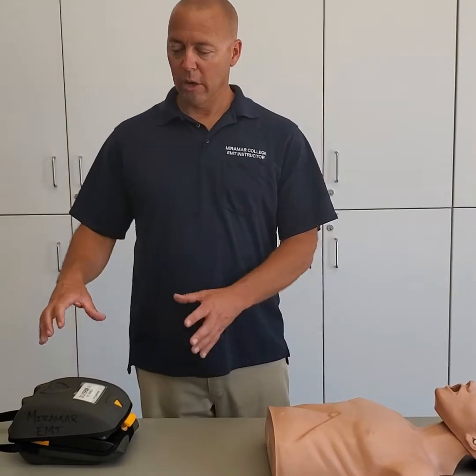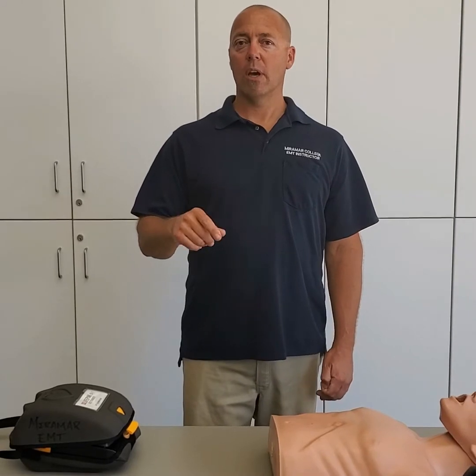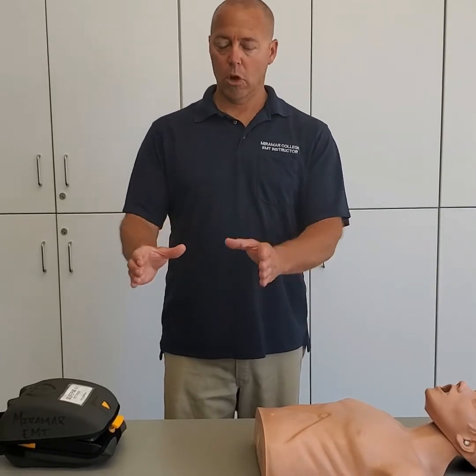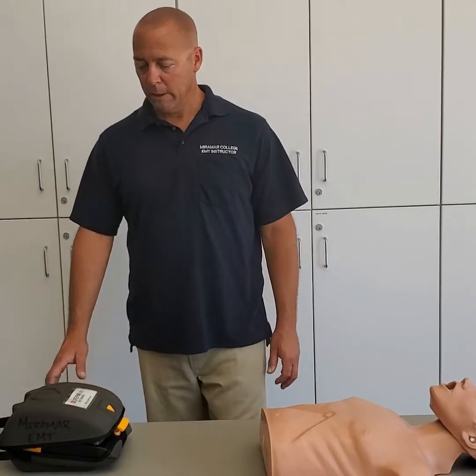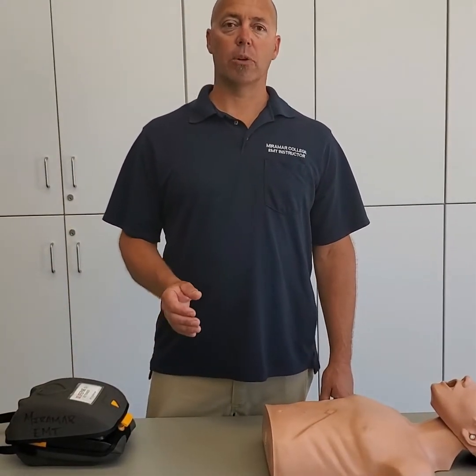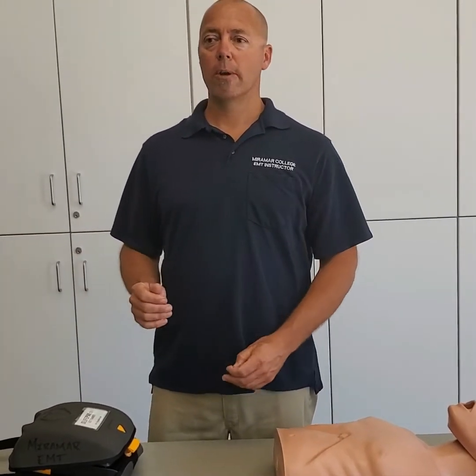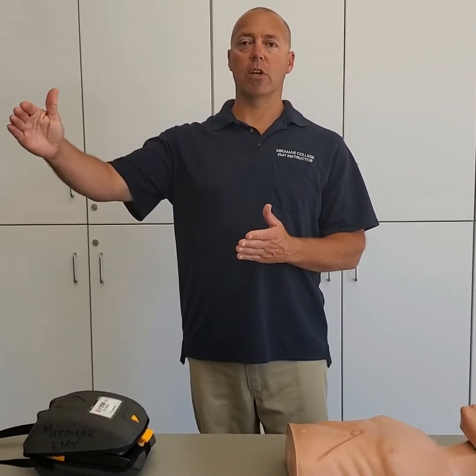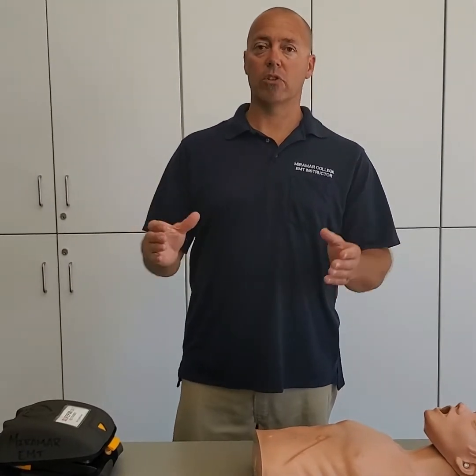In order for us to put this machine on our patient, your patient has to be unresponsive with no pulse and no breathing. Again, unresponsive, no pulse, and no breathing is the criteria for us to apply the AED. Now, the AED can be used on any patient population. It can be used on an infant, a child, and an adult. An adult for AED purposes is going to be anybody 8 or greater. Anybody less than 8 would be considered a child.